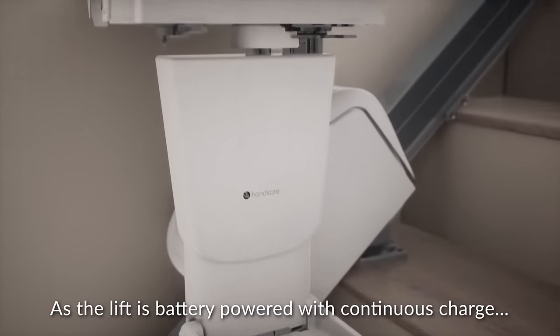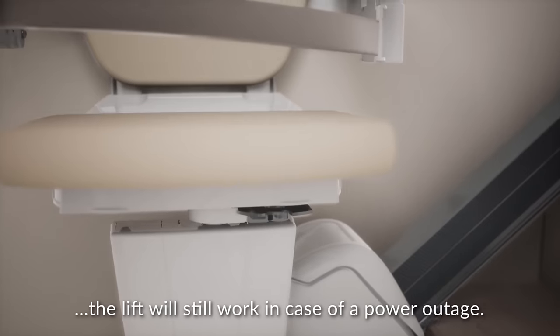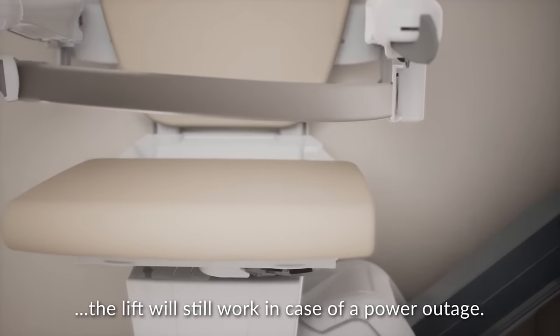As the lift is battery powered with continuous charge, the lift will still work in case of a power outage.